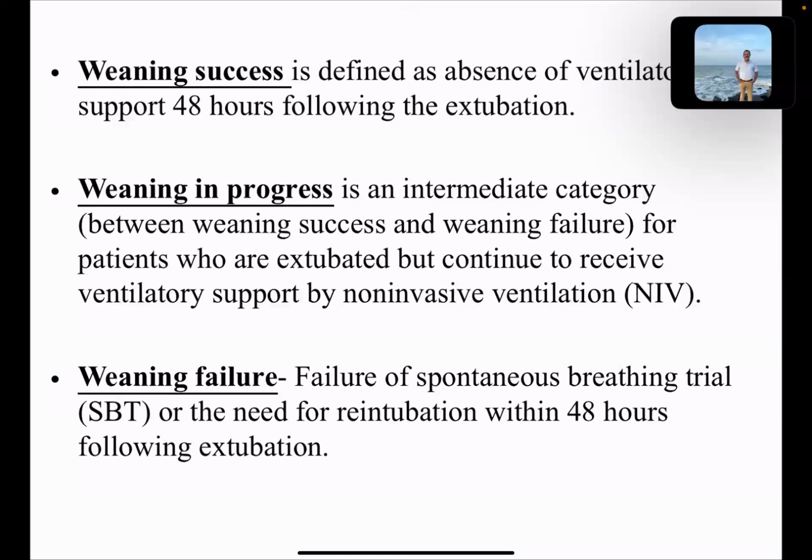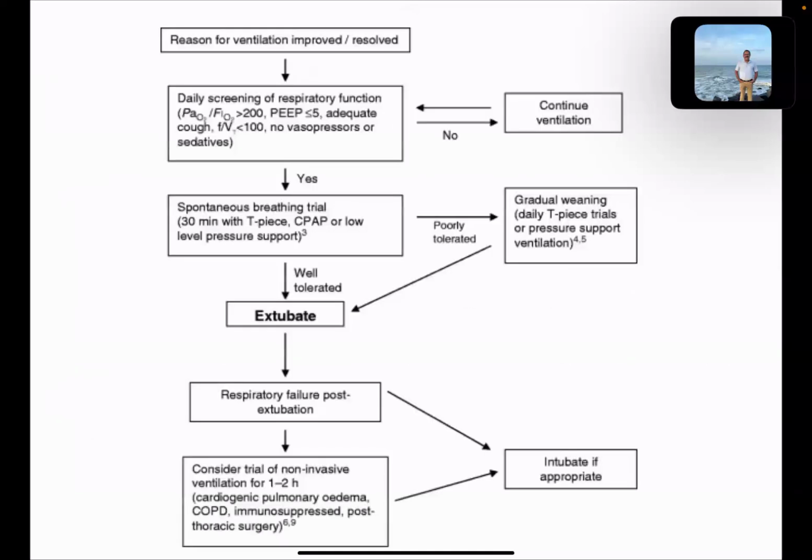Non-invasive ventilator means there is no endotracheal tube, but you give the patient support through a face mask, either CPAP or BiPAP. Weaning failure is when the SBT fails and you have to re-intubate the patient. Then we call it that the weaning has failed. This is an algorithm. I don't know how clear this is.